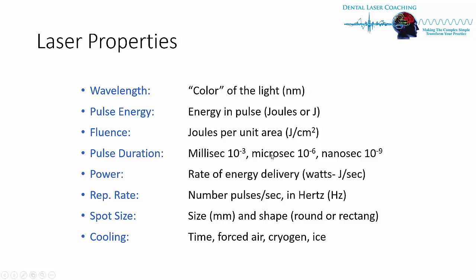Pulse duration is measured in milli, micro, nano, and even in the future picoseconds, which are very short bursts of power. Remember that lasers can be on all the time, but there is a thermal effect to lasers. They have heat, so we do not want to have heat necrosis when we're doing surgery. So that's why we pulse the lasers.